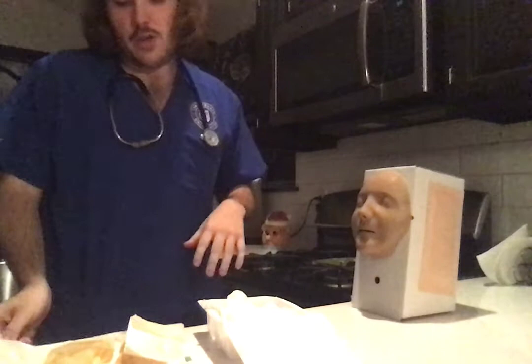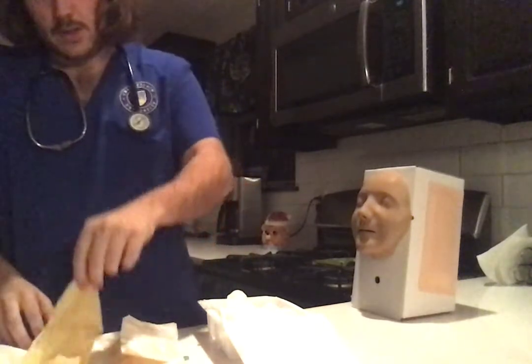This part is a little more step by step. You want to place a glove on your dominant hand first.